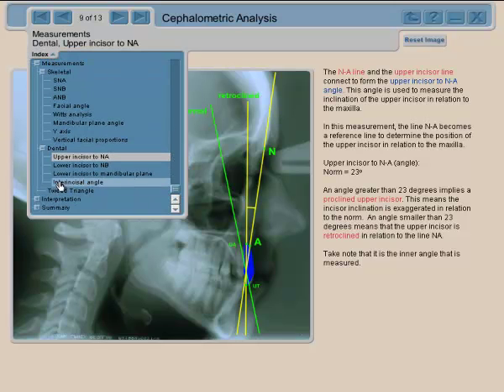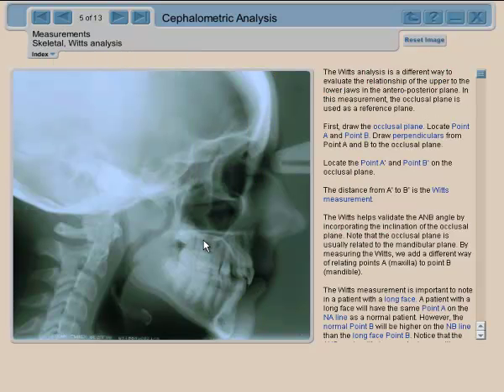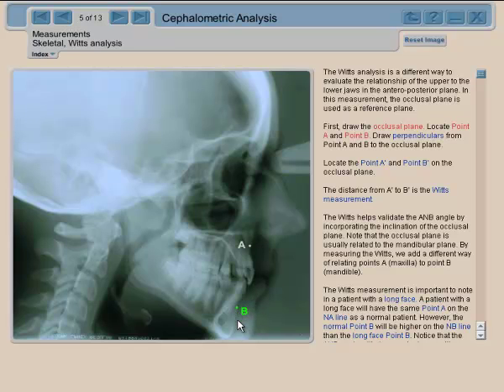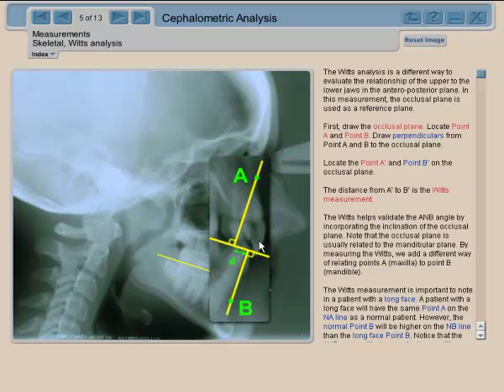There are many measurements. Another one to finish would be the Wits analysis, which uses a totally different reference plane — the occlusal plane. The occlusal plane is right here. You take point A, the most anterior point of the maxilla, and point B, the most anterior superior point of the mandible. You then make a perpendicular to the occlusal plane: A becomes A-prime and B becomes B-prime. A-prime is here and B-prime is right here.